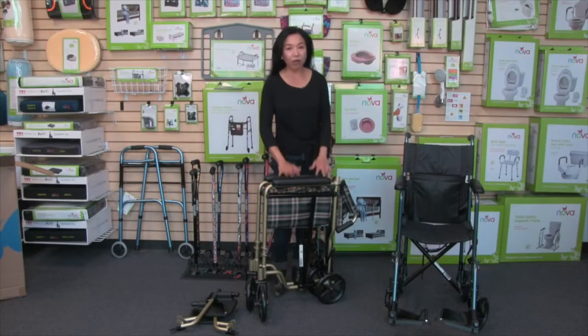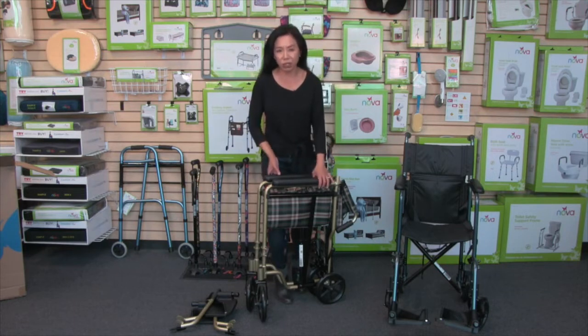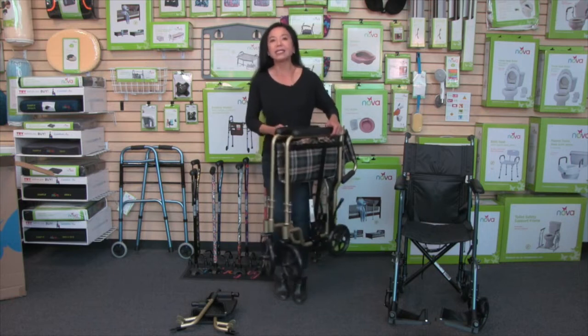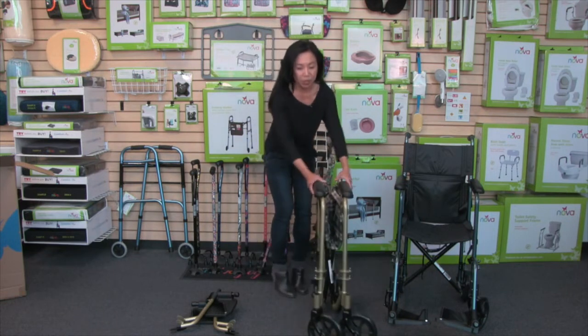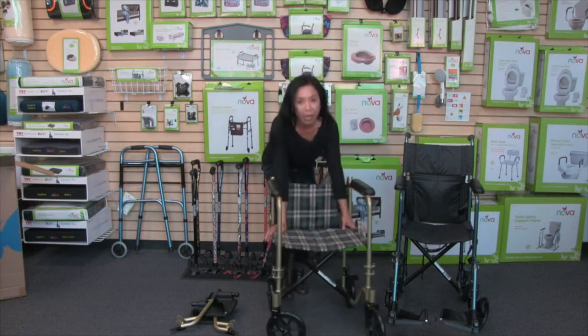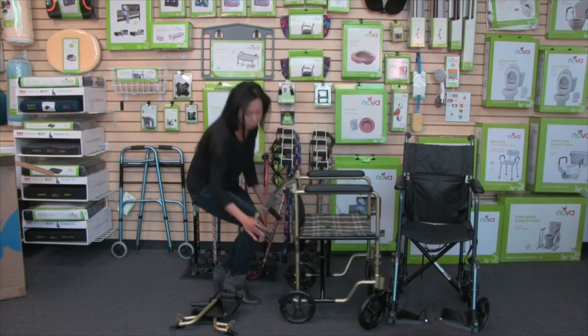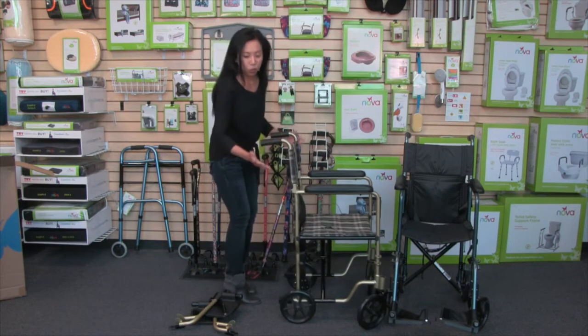Your transport chair will arrive fully assembled. This is also what the transport chair looks like in its folded, compact position — you'll see how compact and lightweight it is, easy to get in and out of the car. To open it up, just pull out on the arms, push down on the seat, and then pull up on the back rest. Pull up on these handles and you want to hear it lock into place.